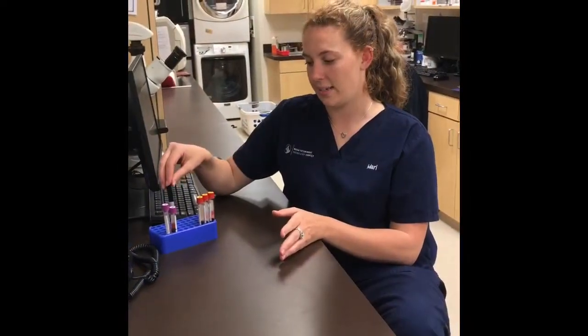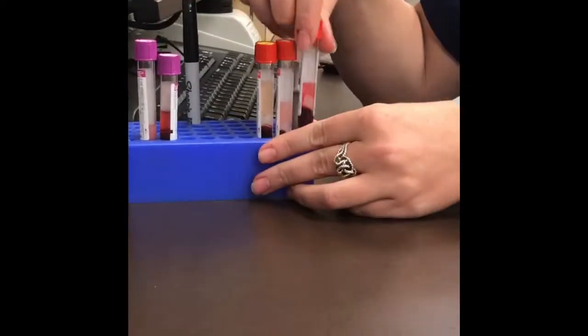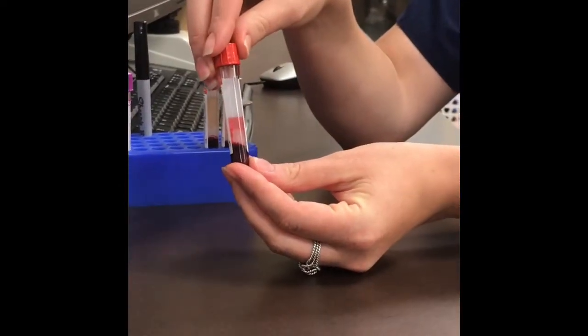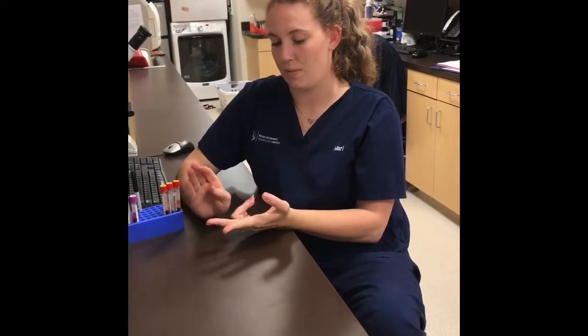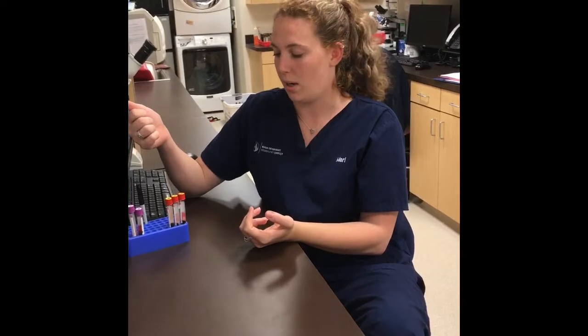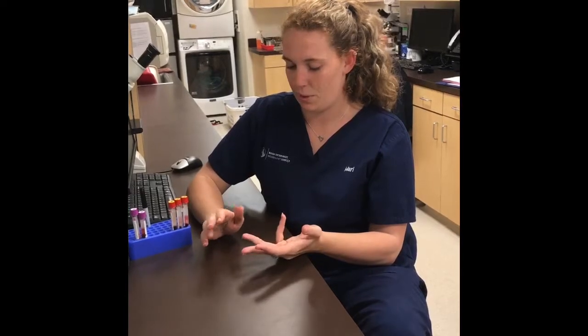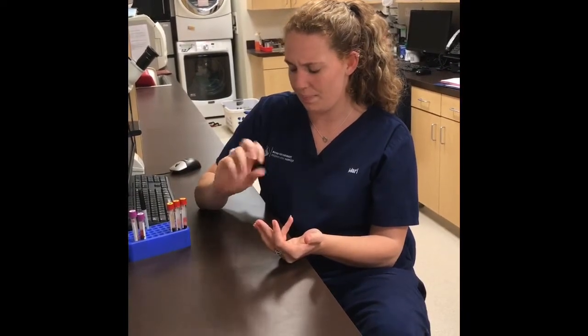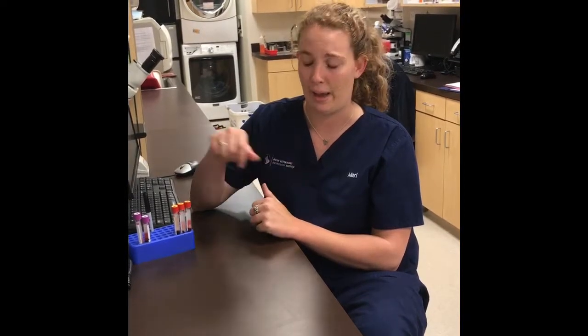So I'm going to go ahead and discuss the causes and effects of hemolysis and lipemia. We've got a couple of examples here. So we're going to start out with our hemolysis. This is an example of a hemolyzed serum sample. Hemolysis can be caused in a couple different ways. If you have excess alcohol on your skin or your hair when drawing your sample, if you force your blood into your tube when you're placing your sample in your tube, if you vigorously invert your sample within your tube, if you draw the blood into a moist syringe, or just by a disease process the pet may have.